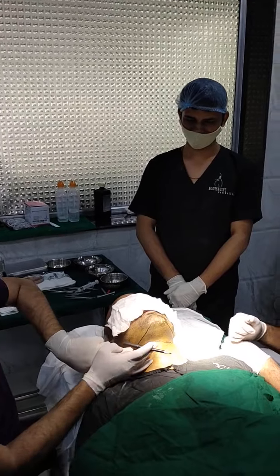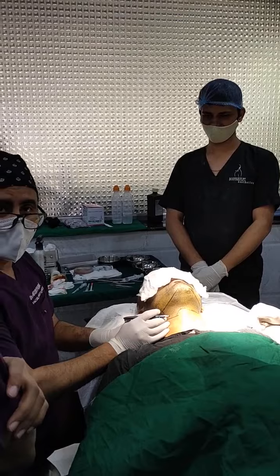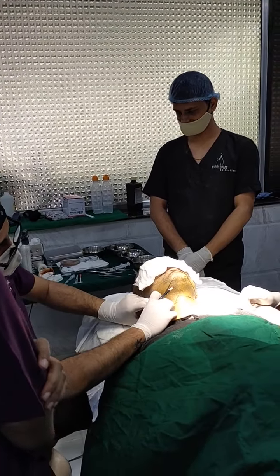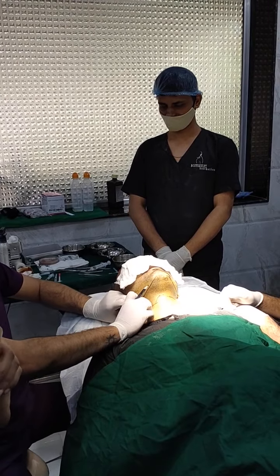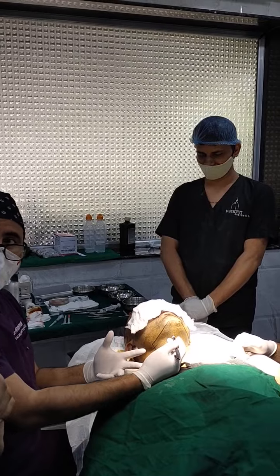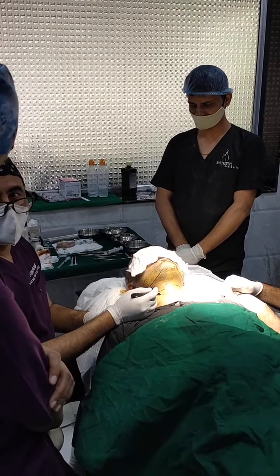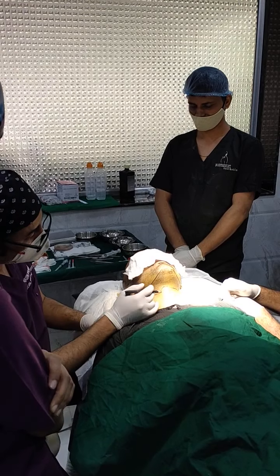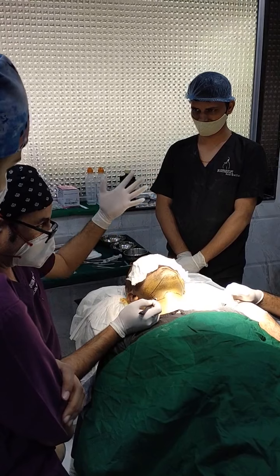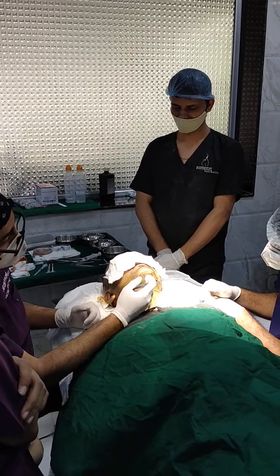So now let us understand how we anesthetize it. As I had told you, it is supplied by the transverse cervical nerve. The transverse cervical nerve normally comes from the posterior part of the sternocleidomastoid, comes like this and goes like this and supplies here. It is practically not possible to hit it, so what we normally do is give infiltration anesthesia. In this case, he's got a little scarring here. Just an add-on: why not take some grafts here and put them here? Anyway, you are anesthetizing it. So we will be doing it.